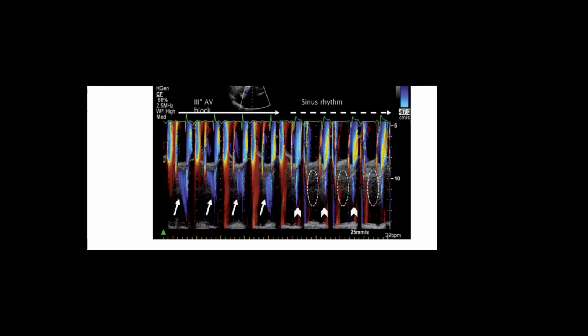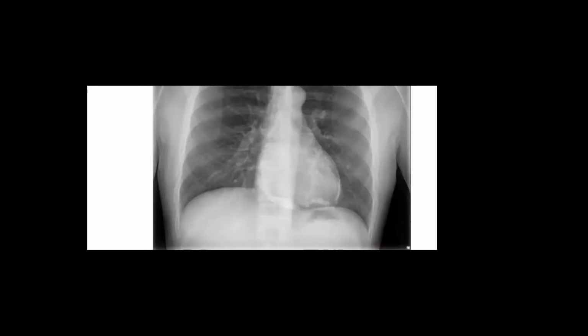Now, X-ray, what does it show? This X-ray, what does it show? So you don't see the pericardial calcification here? There is pericardial calcification.